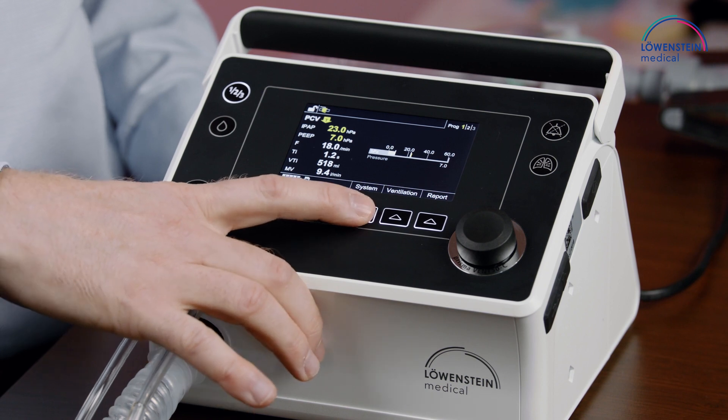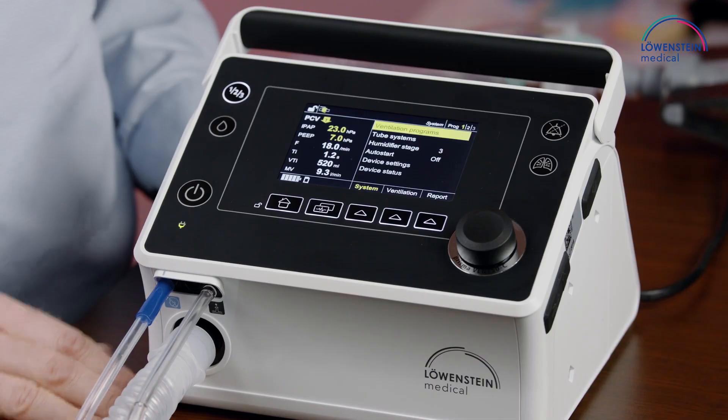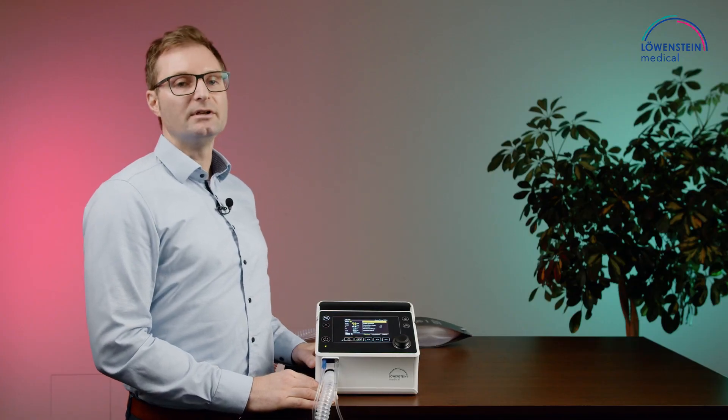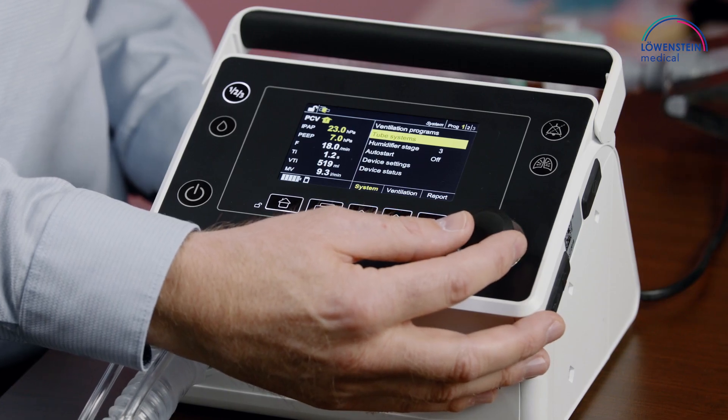In the system menu, we do all settings before the actual ventilation, like choosing the ventilation programs or the tube system and circuit system, including the circuit test.